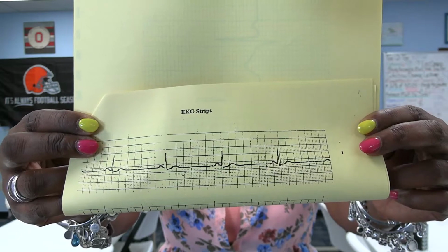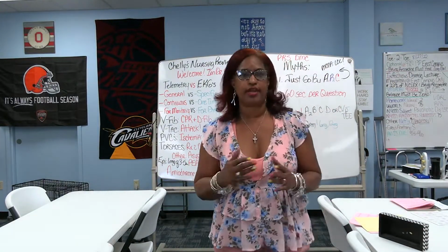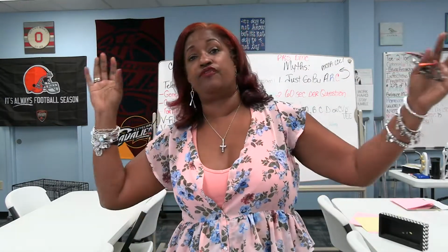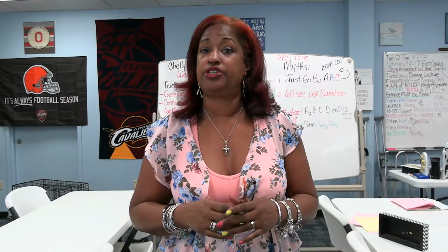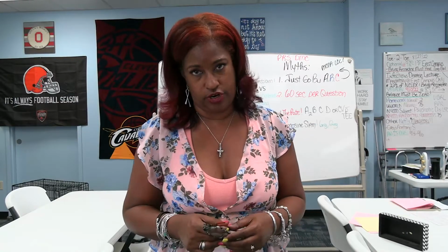All right, we're back. Now, what did I just show you? I showed you a bradycardia. It's not hard. It's not rocket science. The QRSs look very far away from each other, and it's a simple strip that I always start with first.